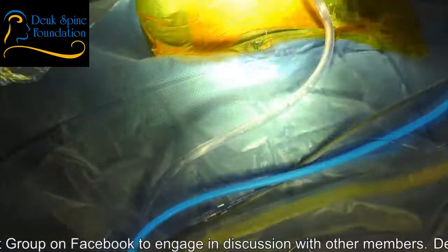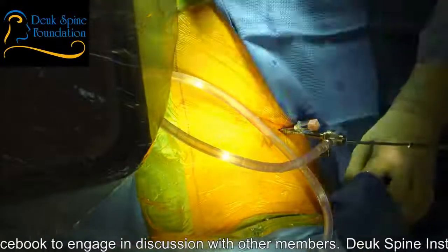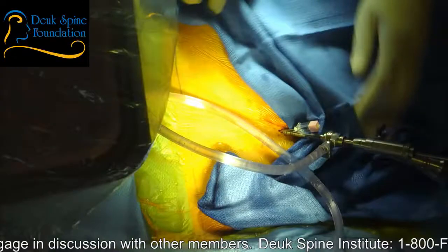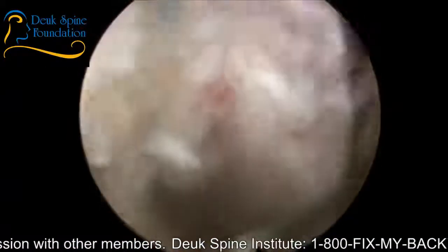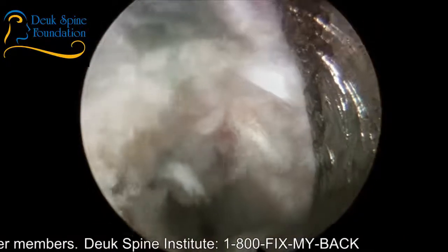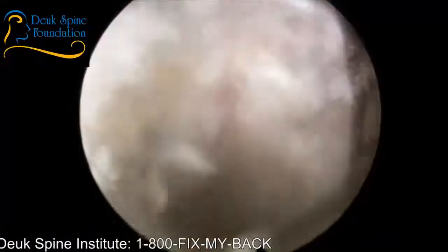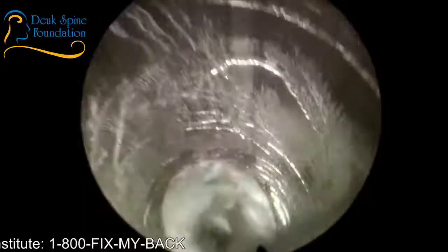Okay. So look at this beautiful surgery. No bone removed, no laminectomy, no foraminotomy. I mean, no weakening his spine any more than the other surgeons have already weakened it with their other surgeries that he's had. It's just so elegant. Such an elegant procedure. Laser, I can get a little bit more of that.